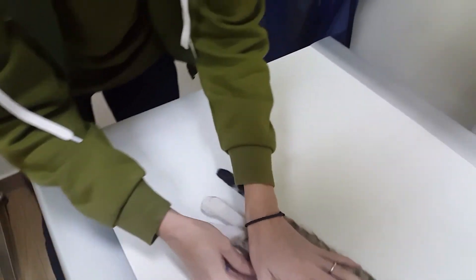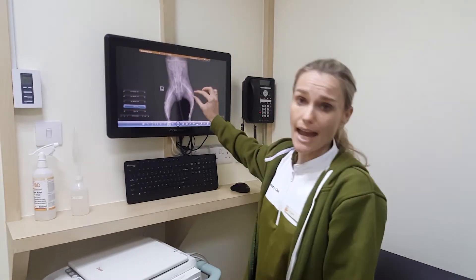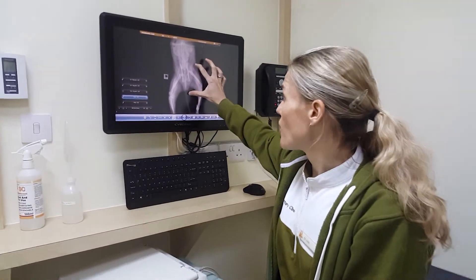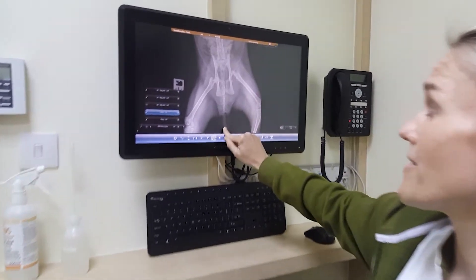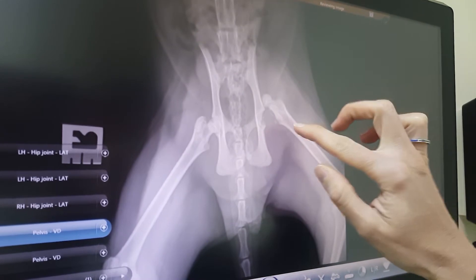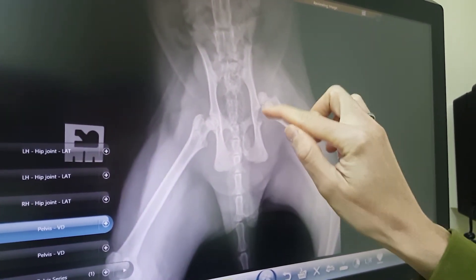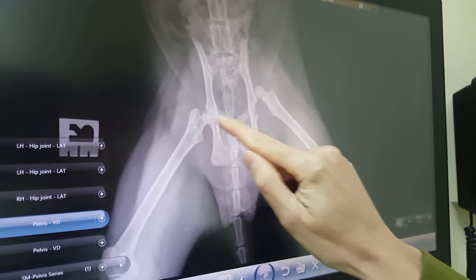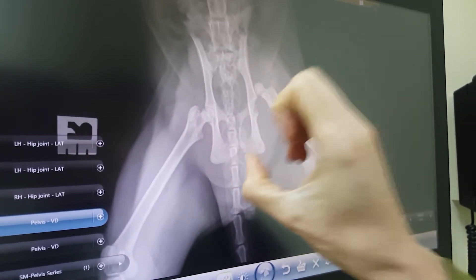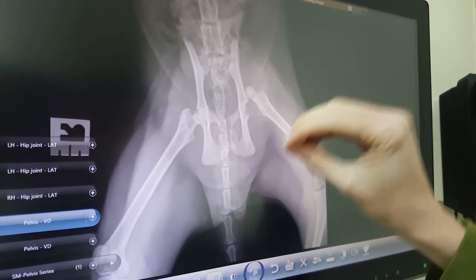So what we found after x-raying him, and sort of on suspicion as well, is that he has a luxated hip. If you have a little look here, this is his hip, and this here is the femur and the ball of the femur, and the joint that it should sit in. Like this one sitting nicely in where it should — the ball and socket effect. This one is sitting high up and has been dislocated.